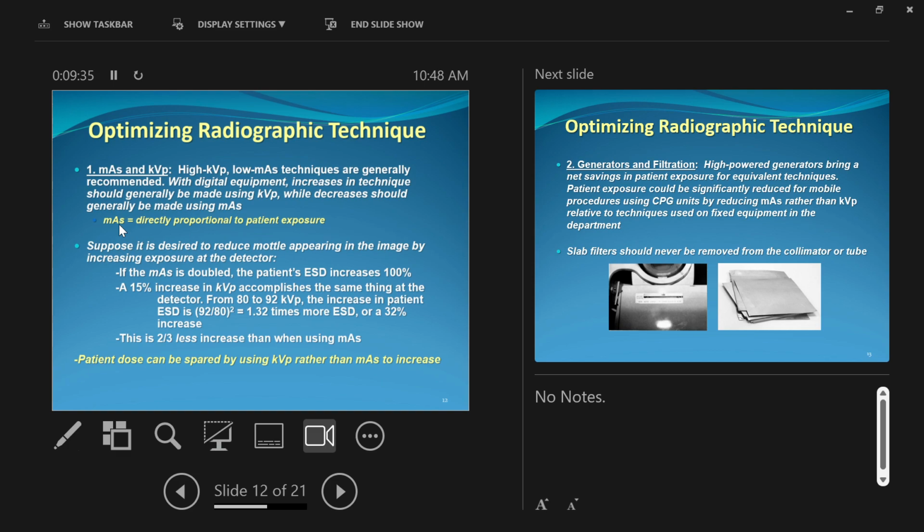I don't have my phone on me, so someone's going to have to do this for me. I know roughly what it should be. Just real quick to do that, we go 80 times 1.15. Or you can go 80 times 0.15 and then add it back to itself, but that's just an extra step you don't need to do. So Abby told us 92 kVp.